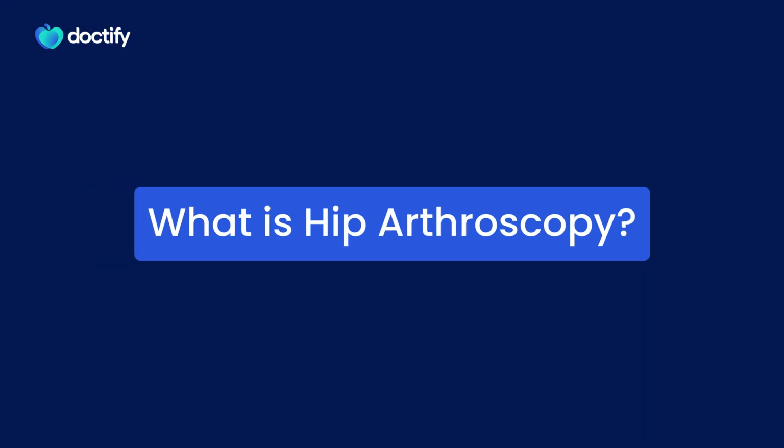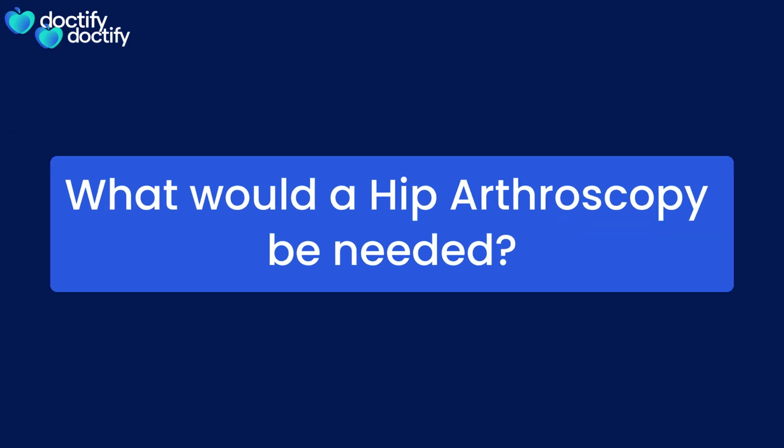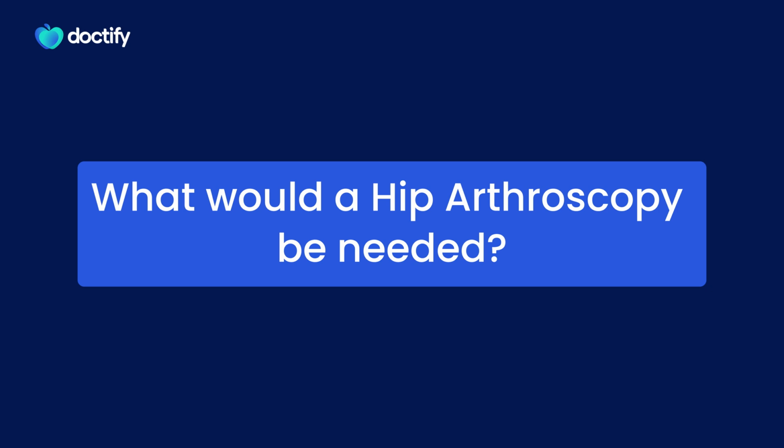So, the question we have been asked is about hip arthroscopy. So, what is hip arthroscopy? This is minimally invasive keyhole surgery that involves putting a camera into the hip using one or two small cuts. Usually we make at least two cuts and sometimes a third one to take a look inside and to treat any potential problems.